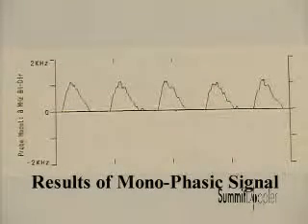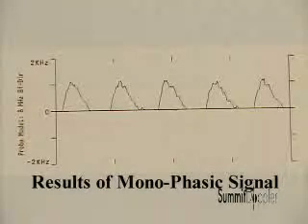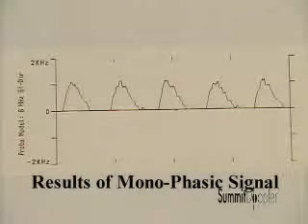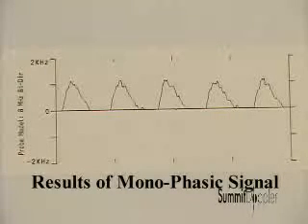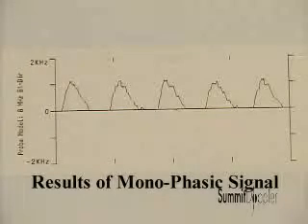Here is a set of waveforms with the characteristics of abnormal posterior tibial flow. The acceleration and decay times are slow, the diastolic components are absent, and the waveforms have somewhat diminished height. These waveforms are typical of a patient with moderate to severe arterial disease.